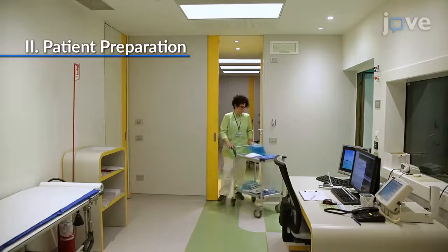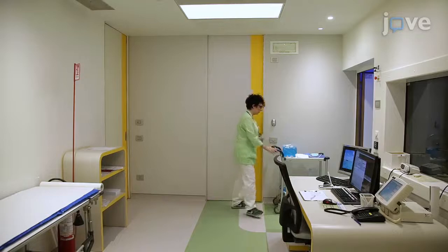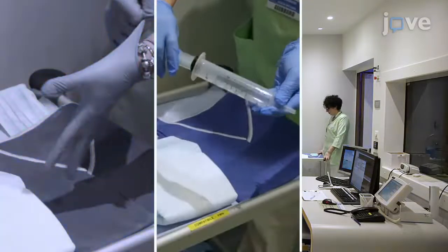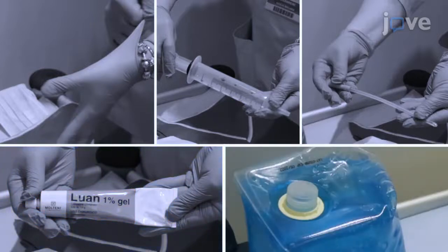Before beginning the examination, place a trolley inside the diagnostic room, equipped with all the necessary instruments and supplies, including gloves, syringes, a catheter, lubricant jelly, and acoustic gel.